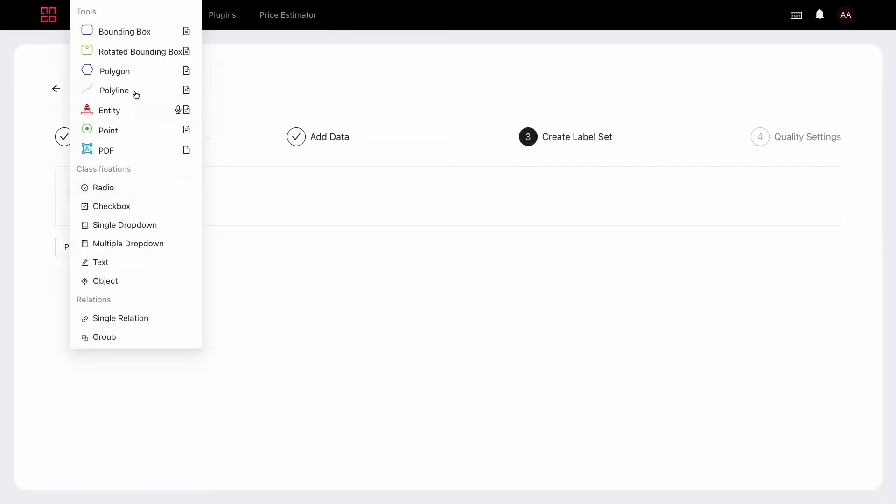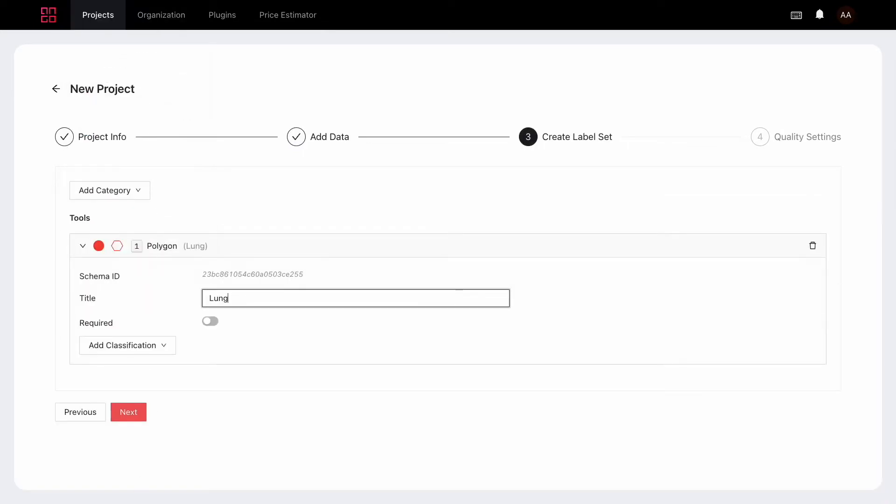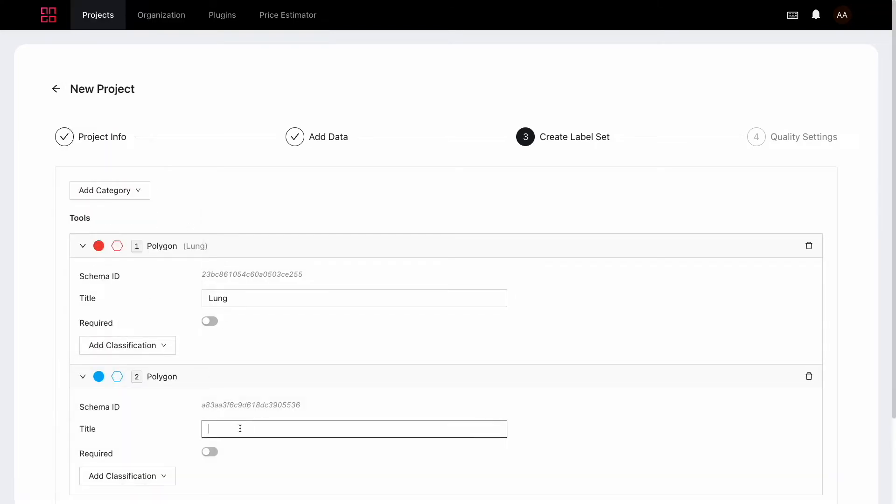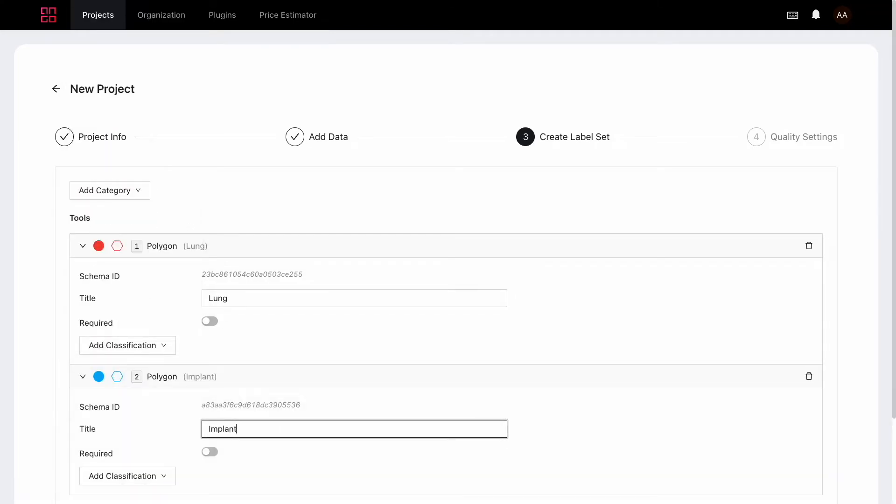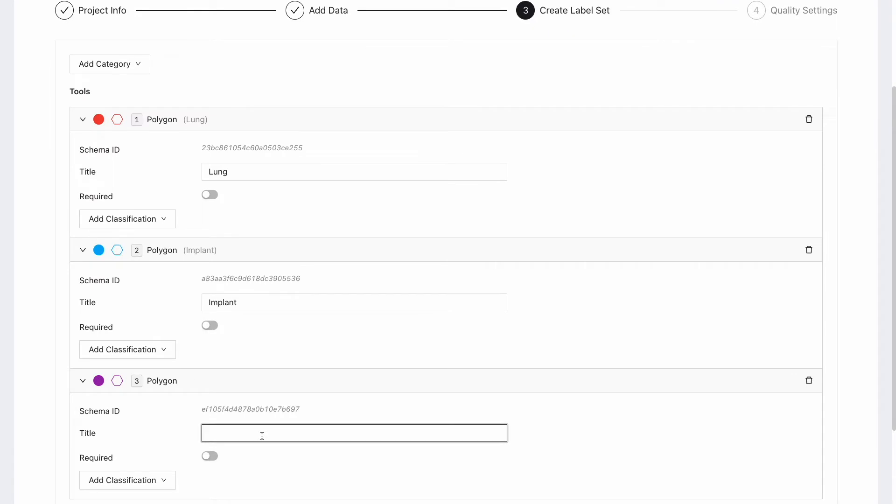Then let's create classes for our annotations. I'll be labeling lungs, implants, and kidneys so that's what I'll add. There'll be polygons in my case but you'll pick the one that's right for you.